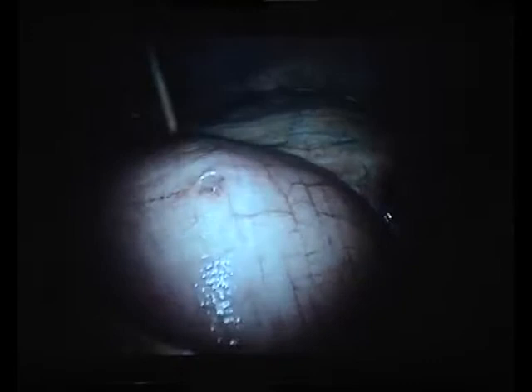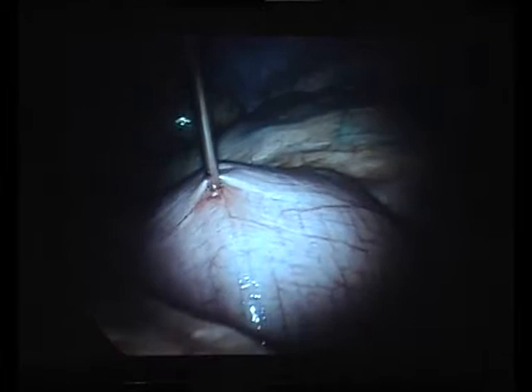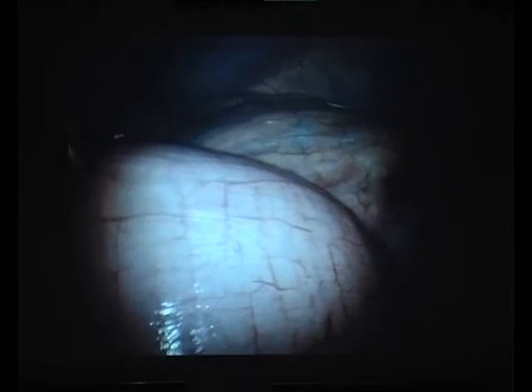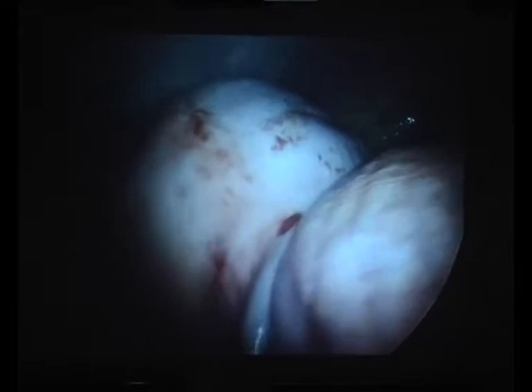And I have punctured the abomasum near the omasum. If we would insert the toggle in this position, we would take the fixation point directly near the sternum, but we usually fix it near the umbilicus, so we have to bring in the toggle more caudal in this part of the abomasum. And here you can see the net covered part and the gray part, and we bring in the toggle in the gray part of the abomasum.